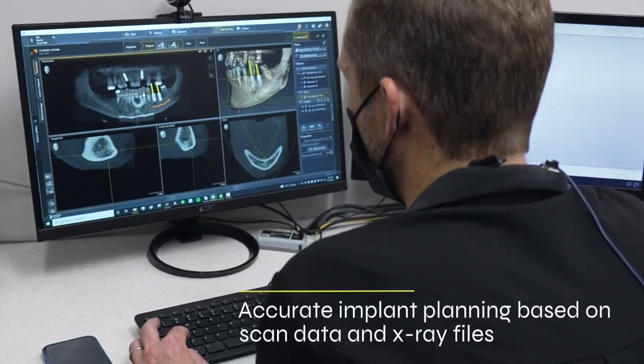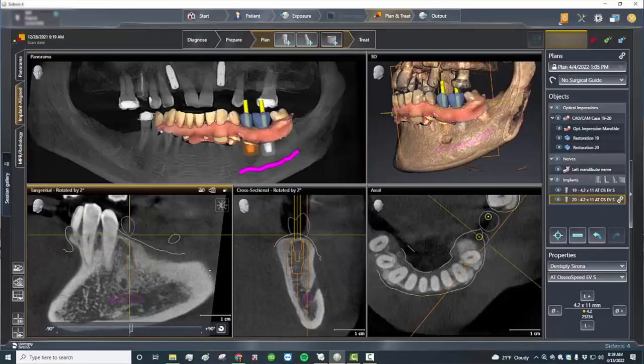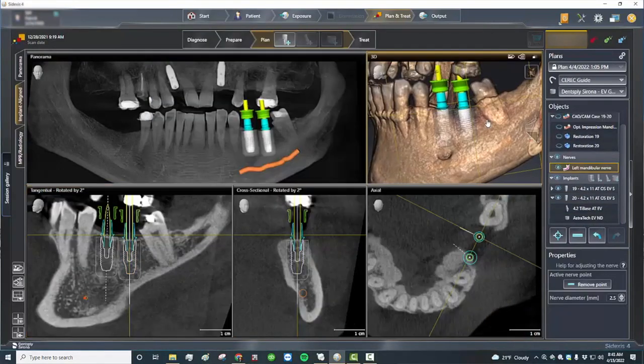After getting that exported file, we're going to bring this into the implant planning software and merge it to the CBCT data. Having all this data fused together, we're going to be able to accurately plan the implant to get it into the correct location.